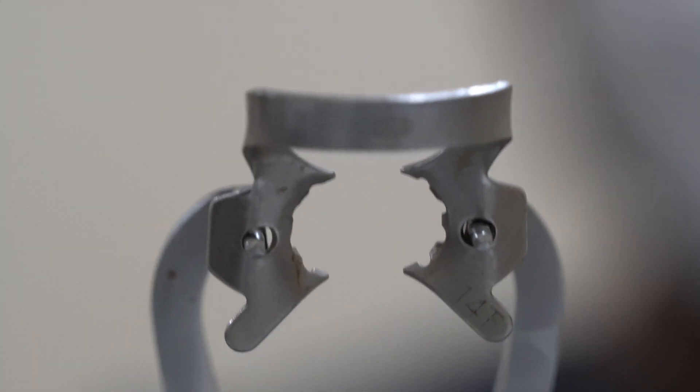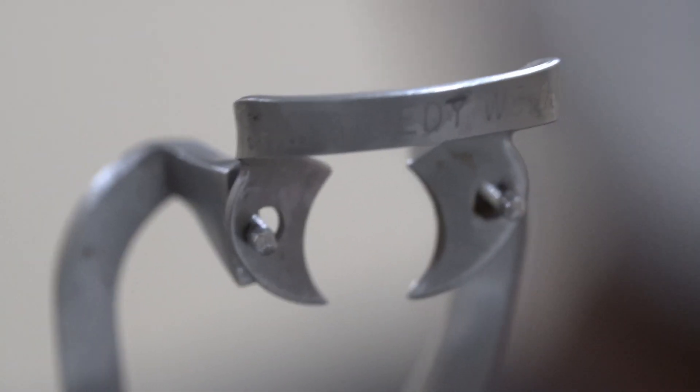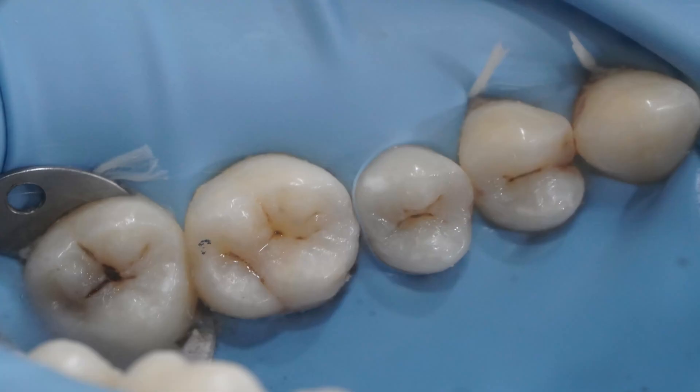There are some situations where I cannot use the 56T — these are very rare occasions, mostly maxillary second molars and in some cases mandibular second molars. In these cases I choose two other clamps: the 14T clamp from KSK and the number 3 clamp from Hufridy. I use them about 10% of the time. The number 3 clamp is wingless, so it can be placed more easily on teeth without sufficient buccal space. The 14T is usually used for smaller molars and I very rarely use it — I keep it as a backup.